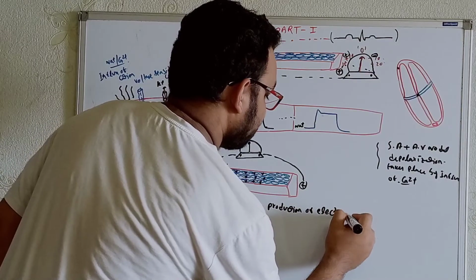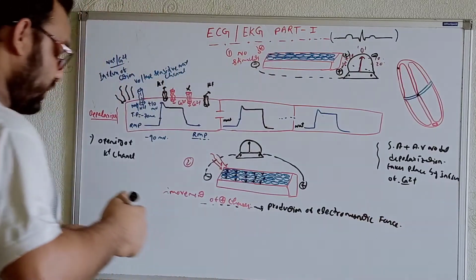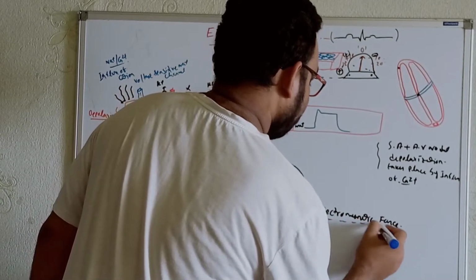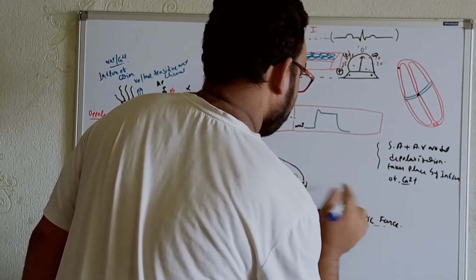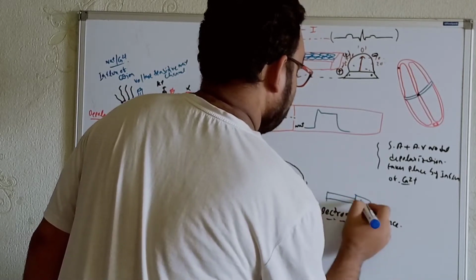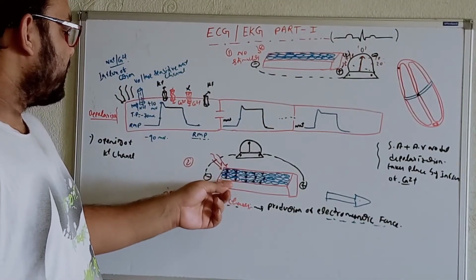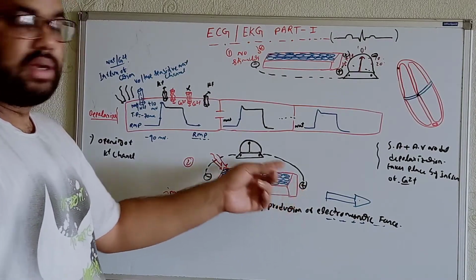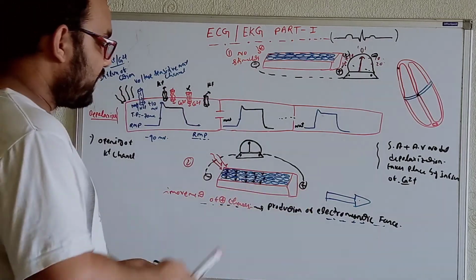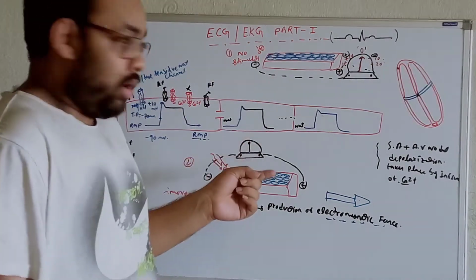Electromagnetic force. Now we can represent the electromagnetic force in terms of vectors. So for that, we'll draw a vector, for example, in this way. Now try to understand from this figure that whenever we get positive charges, see the positive charges, they are going towards the positive electrode. In terms of the galvanometer's rules, as we know, the flow of the positive charges will be towards the positive electrode.